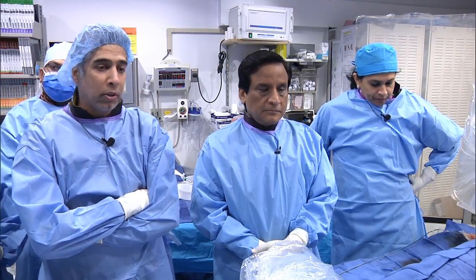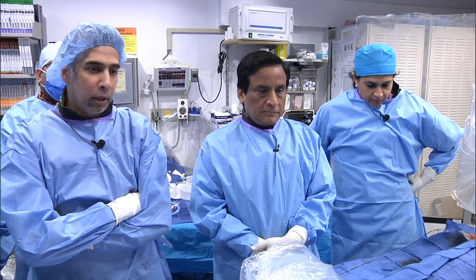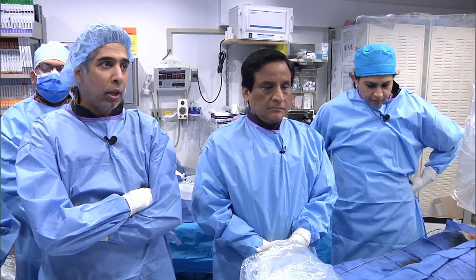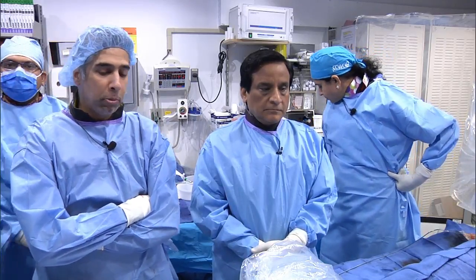We will sometimes use a transulnar if we have a failed transradial. And there is some small trial data that shows that even at the same sitting, if you fail with transradial access, it's safe to access the ipsilateral ulnar in the same sitting. So not a huge part here, but we do. And I'd be remiss not to mention, in those cases we will use ultrasound before giving up on access and converting to a transfemoral case.